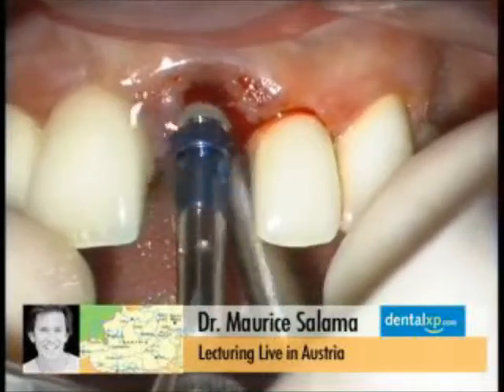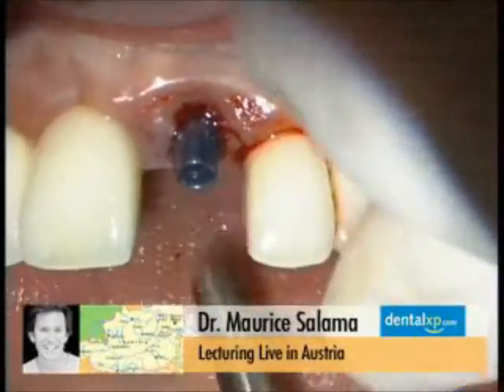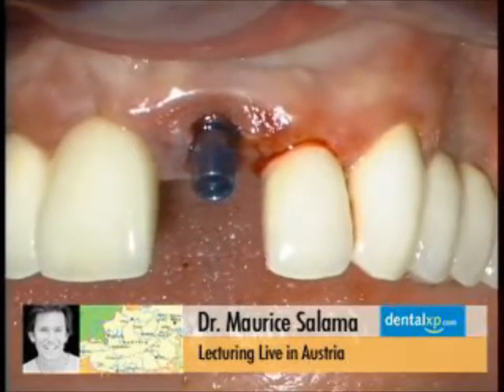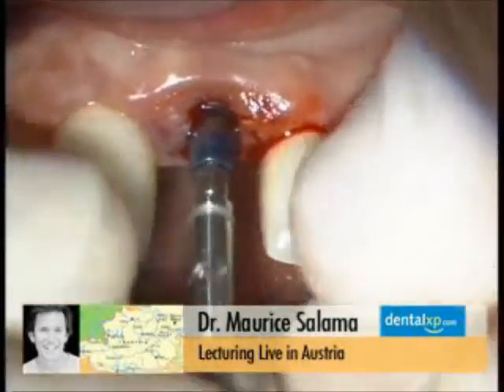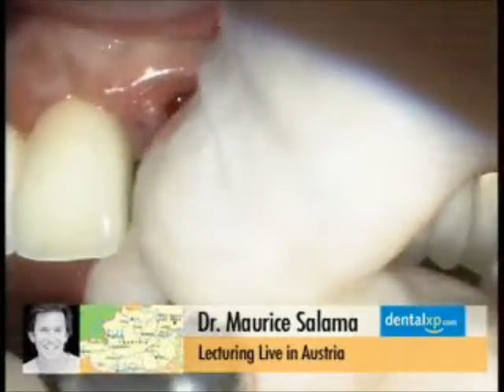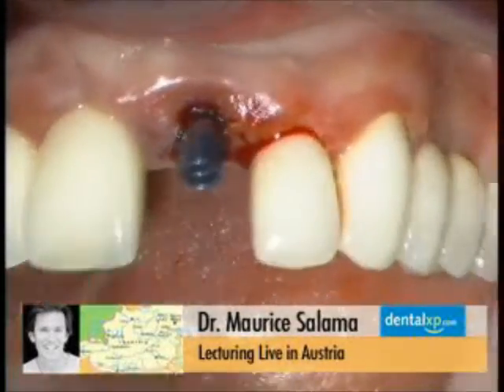And we shaped it in this case like the scallop form of the underlying bone that we'd like to achieve in order to regain soft tissue scallop for our final restoration. And what Henry's doing here is he's extracted the tooth and cleaned it out, and he's going to go ahead and place the implant in the area of this tooth that eventually failed.